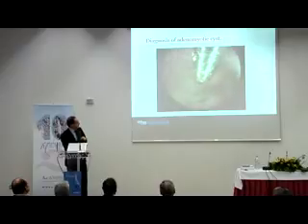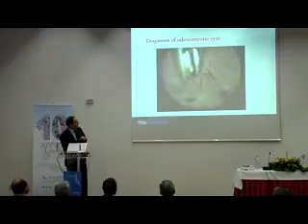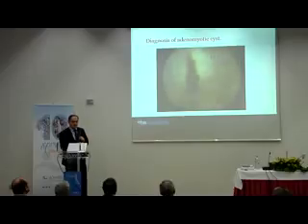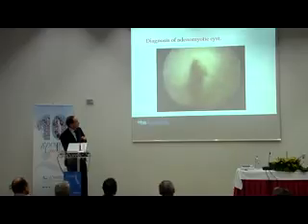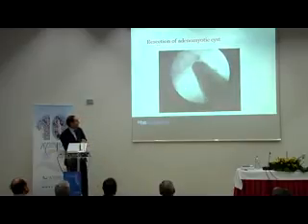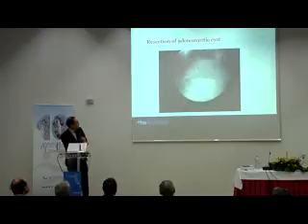Now let's explore this area. Let's go and look carefully. What do we see? Chocolate. Belgium chocolate. No. Real chocolate. The chocolate dye which you see when you open an ovarian endometrioma, it's just the same. We look inside and we will remove the tissue here because we need the full pathology. We need to dissect, we see the aberrant vascularization, and carefully under vision we have to dissect.